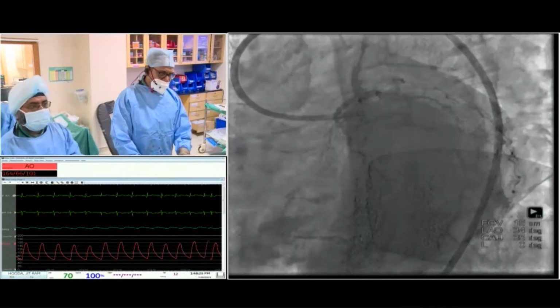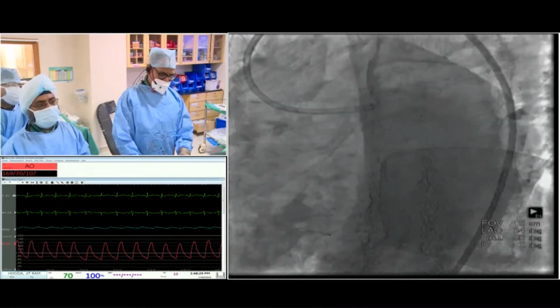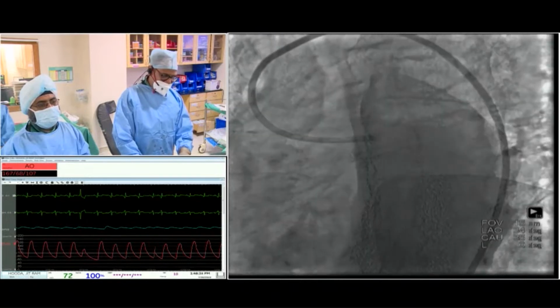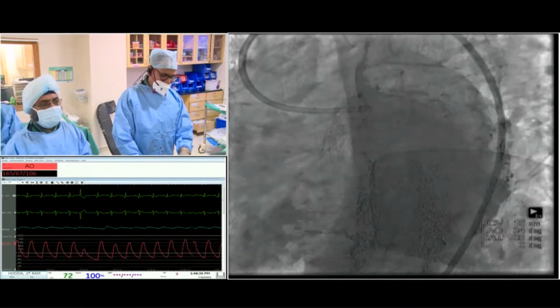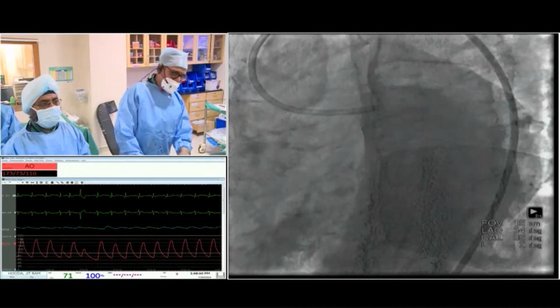Our patients are also simulating West, it looks, sir. We saw circumflex. Our patients are also simulating West, okay. I am saying this because just now we saw a 92-year-old lady done, now you're showing an 86-year-old person. Please go ahead, sorry. Yes, so he's truly an octogenarian, 87.